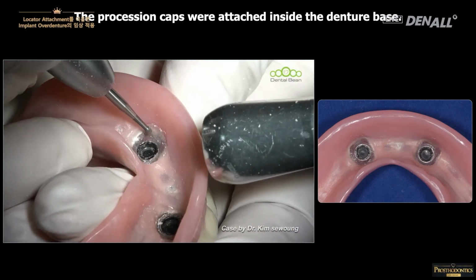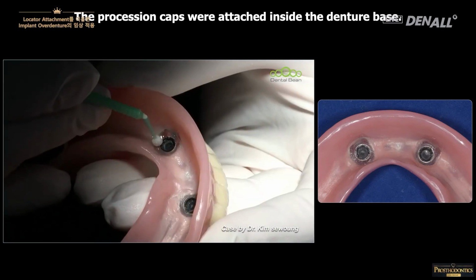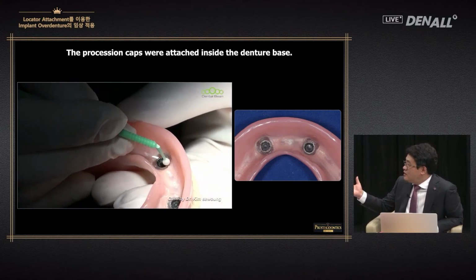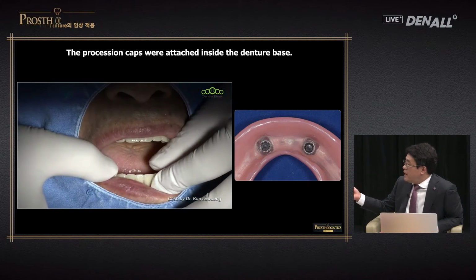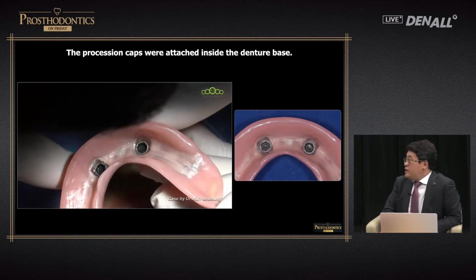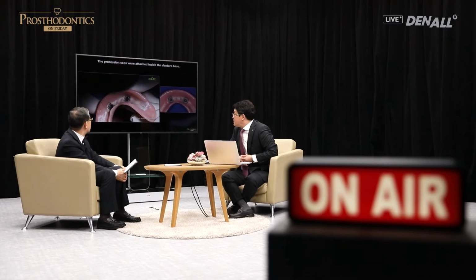Once you wipe it using the gauze, because Vaseline has been applied here, you can remove resin very easily. At times, there can be air bubbles and additional adjustment may be required extraorally. After you do that, you need to position it within the oral cavity once again and let it harden, because if you let it set extraorally, it may cause problems with insertion. Air bubble is addressed like this.